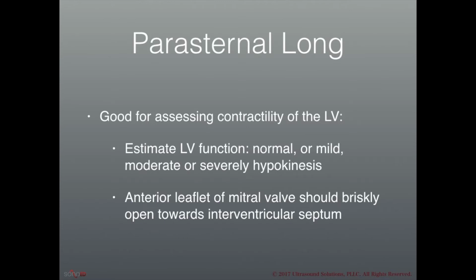When you're assessing the parasternal long view, you really want to make sure that your ultrasound view is right in the middle of the chamber of the LV and not off to one side or the other where you could pick up some of the wall. And I'll show you an example of that upcoming.